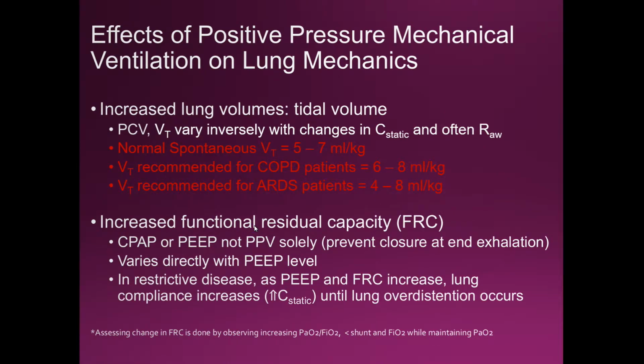Increased lung volumes and our tidal volume. So in pressure control ventilation, tidal volume varies, correct, because we are controlling pressure. It varies inversely with changes in static compliance and often airway resistance. All right, so because static compliance and airway resistance is dealing more with pressures, right? Pressure is inversely related to volume. So that's where the statement comes in. Volume is inverse based on our pressures.